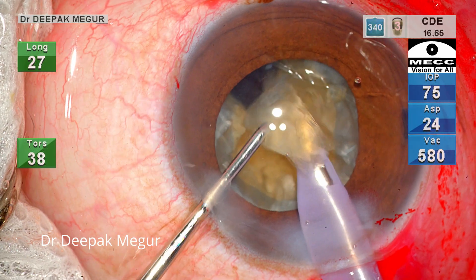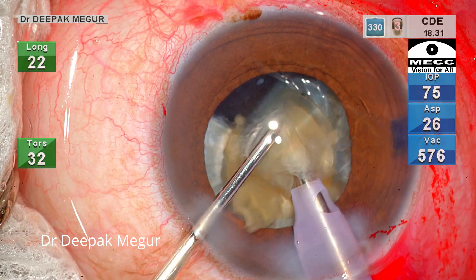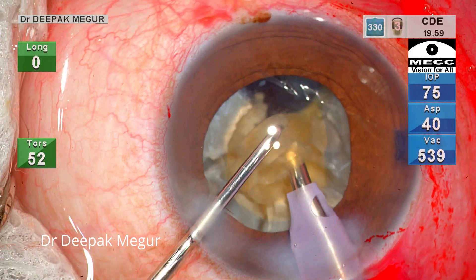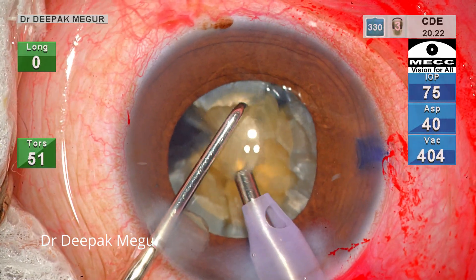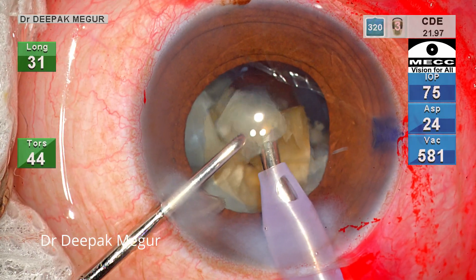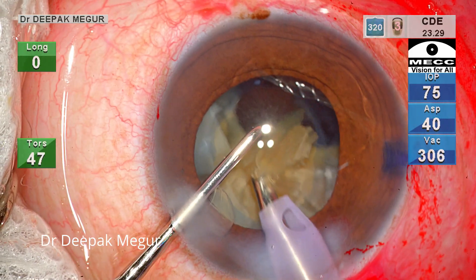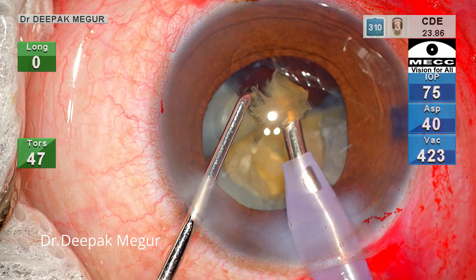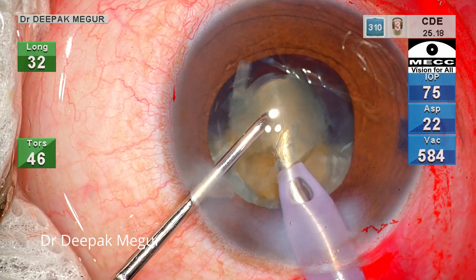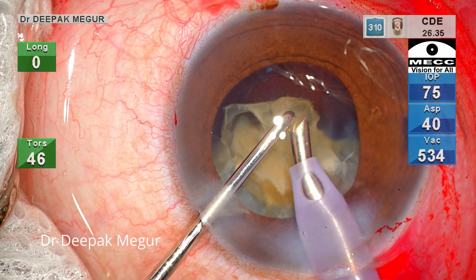We don't get the crack in a single movement at all. That's why we shouldn't keep struggling by extending the chopper laterally — instead, go deeper and then separate. Once the fragments are divided, it's child's play to remove them. Because the rhexis is smaller, we also get an idea of the plane at which we are emulsifying. In this case, the fragment is dancing around near the vicinity of the capsular bag, which reassures me that the plane of emulsification is not anterior. The challenge is not fragment emulsification — the challenge is how we divide the nucleus when dealing with a smaller rhexis.